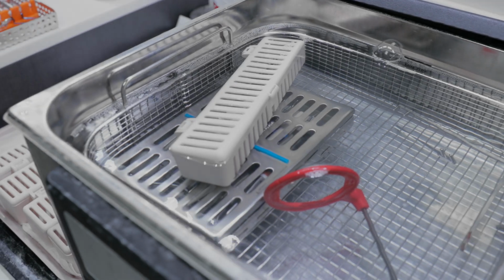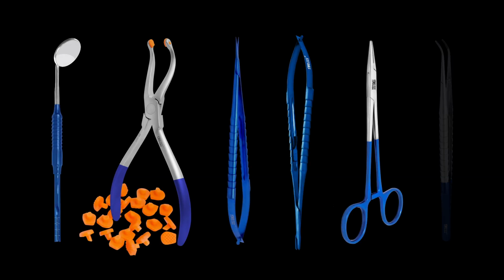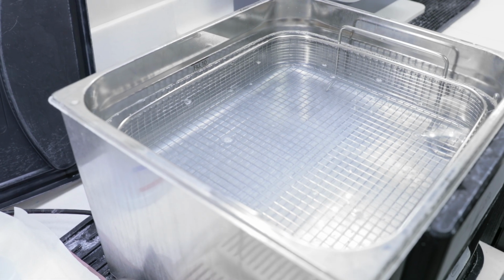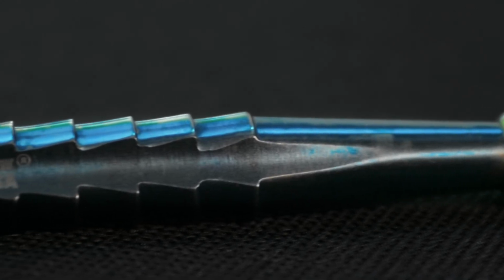Ultrasonic cleaning is not recommended for scissors, needle holders with tungsten carbide inserts, or other sharp or delicate instruments. Nor is it recommended for instruments that are not 100% steel, like mouth mirrors, rubber, titanium, tungsten carbide inserts, or diamond-dusted tips. The ultrasonic vibrations can chip, break, or corrode welded parts.